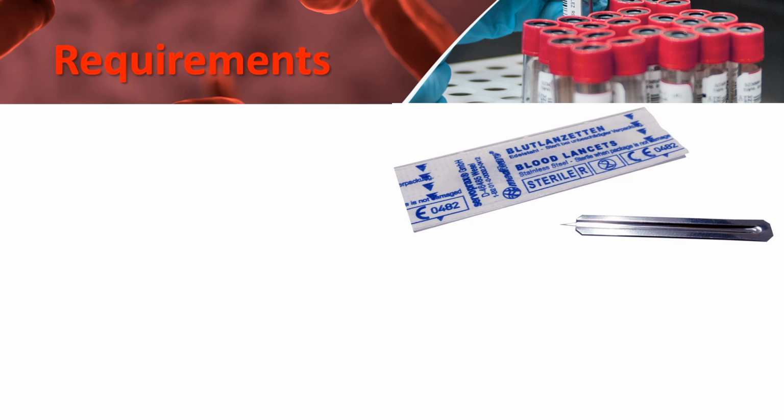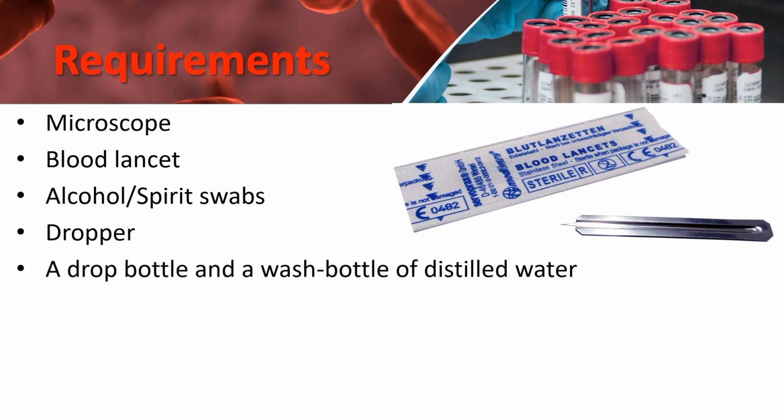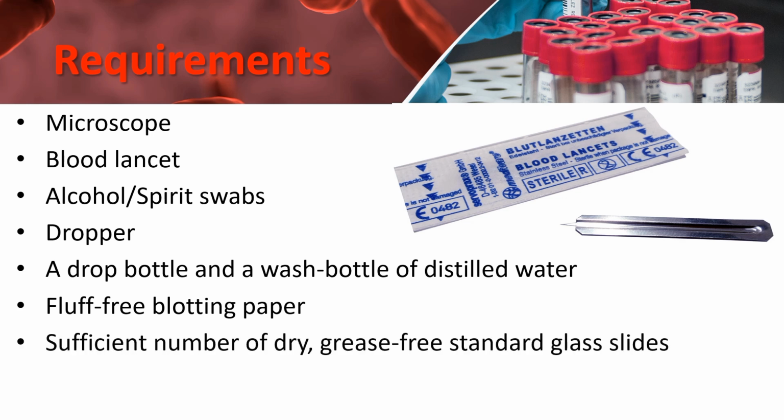What are the requirements for this practical? In order to perform this practical, you will need a microscope, blood lancet, spirit or alcohol swabs, dropper, a drop bottle and a wash bottle of distilled water, fluff-free blotting paper, sufficient number of dry, grease-free standard glass slides, and Leishman's stain.